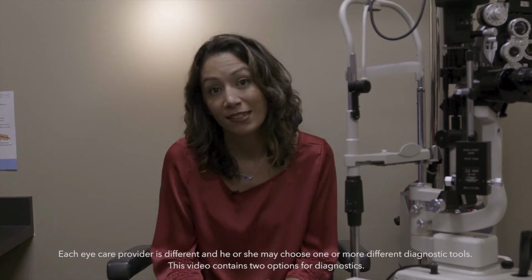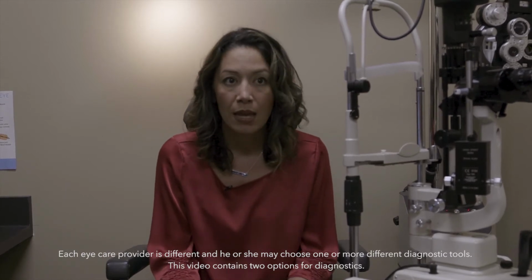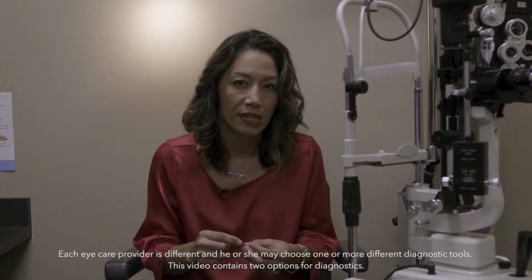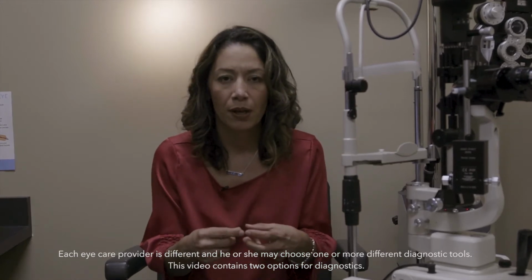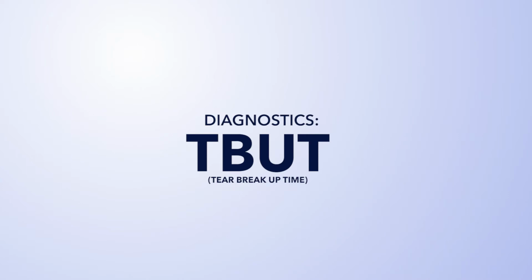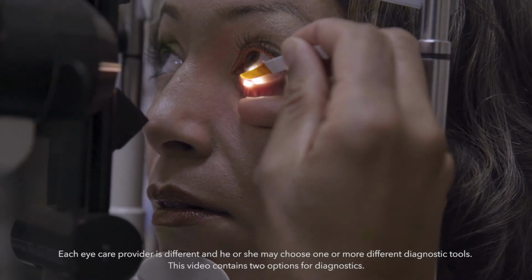So now the next test he's going to do on me is TBUT, or TFBUT, which is tear film breakup time. He's going to use something called fluorescein, which is a dye, and they'll put a droplet of it in my eye using this paper. You'll see. Watch this. This fluorescein. We're going to do the left eye first.